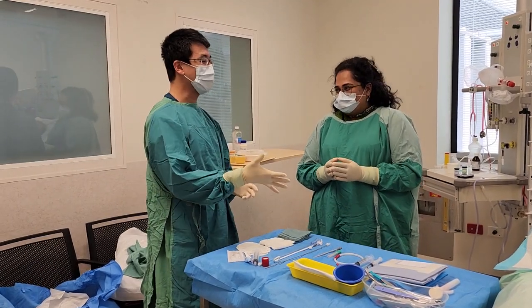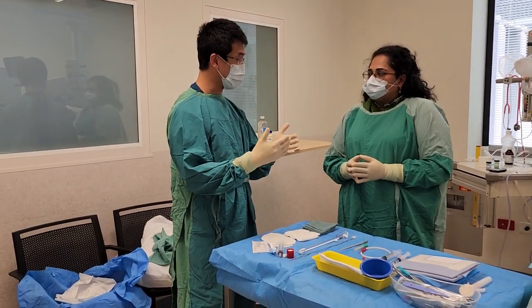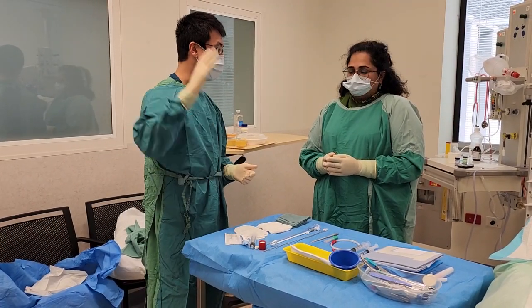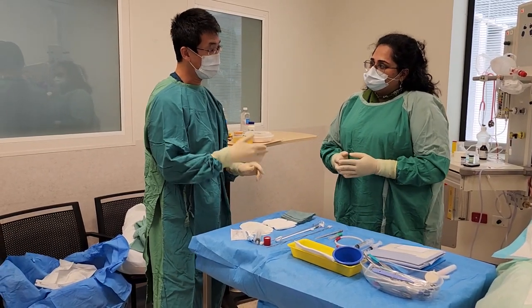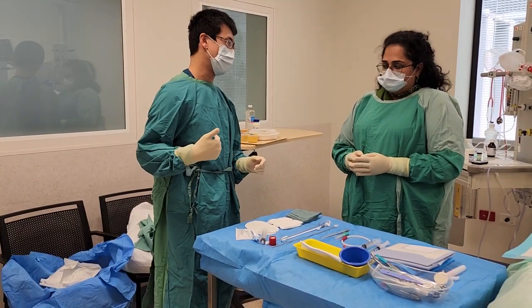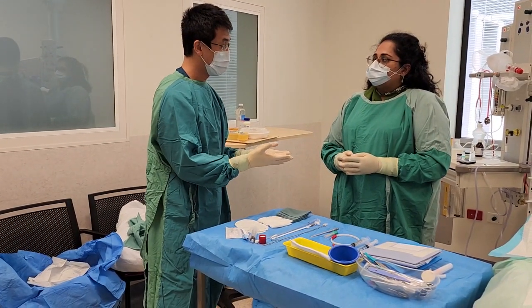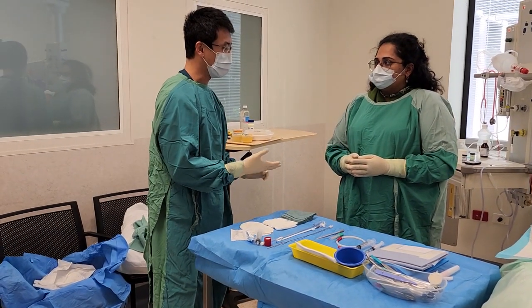Wonderful. Yeah, the triangle of safety is very important because there are some significant structures that you might damage if you go outside of the triangle. So basically you have to position the patient in a sunbathing pose, I like to call it, with the arms up. The inferior border, as you said, is the 5th intercostal space, also where the nipple line is. Anteriorly is the pectoralis major, posteriorly is the latissimus dorsi. If you go too far below, on the right side, which is what we're doing, what structure might we hit? Diaphragm or liver? Yeah, the diaphragm and liver. You definitely don't want to do that.